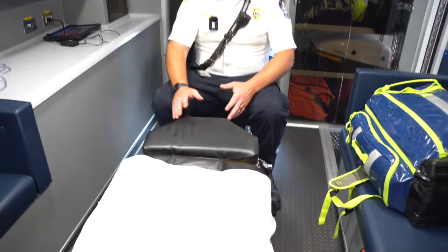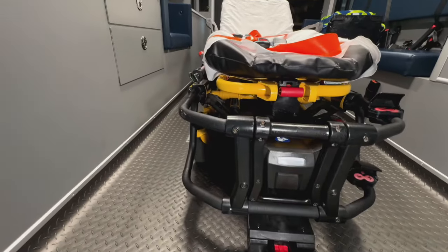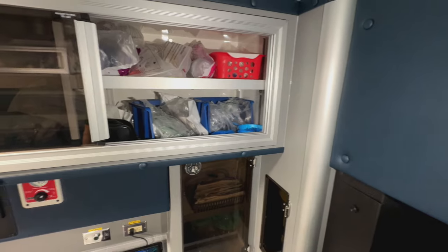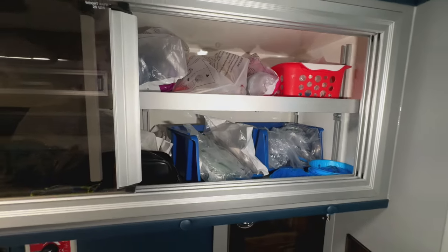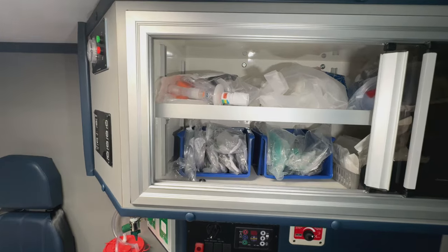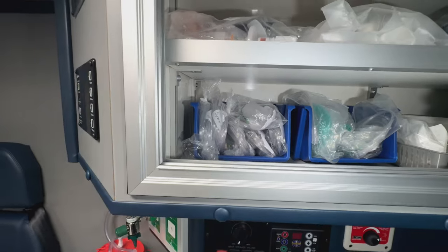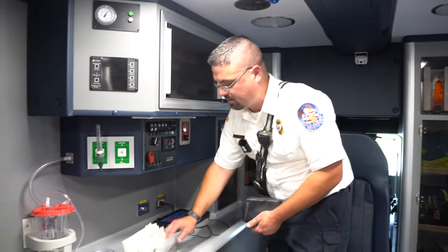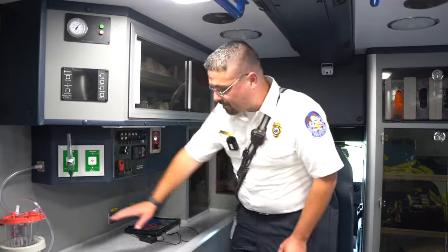In the back, this is where the patient lays — head at this end, feet at the other. The ambulance is built around the patient's position. Since the head is here, we do breathing treatments nearby, so all airway stuff is set up here: oxygen masks, nasal cannulas, different airway adjuncts, CPAP — a mask that pushes oxygen into the lungs — and both nasal and oral airways.